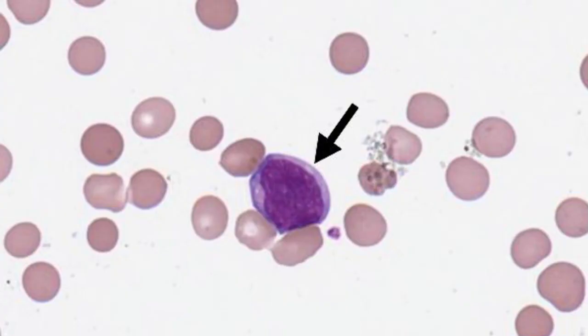See, look. The arrowed cells are blast cells, and more specifically lymphoblasts. Lymphoblasts are the most immature cells of the lymphoid series. They are most commonly seen in acute lymphoblastic leukemia and lymphoid blast crisis of chronic myeloid leukemia. These round to oval cells range in size from 10 to 20 micrometer. The N/C ratio varies from 7:1 to 4:1.